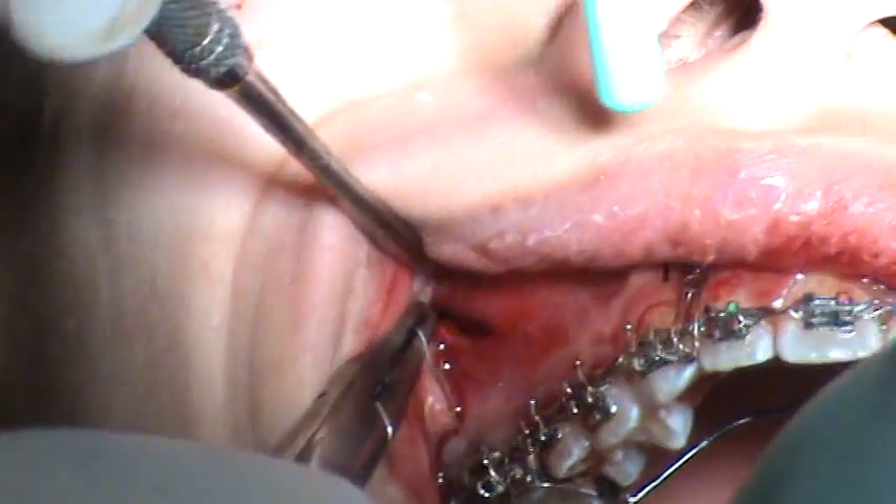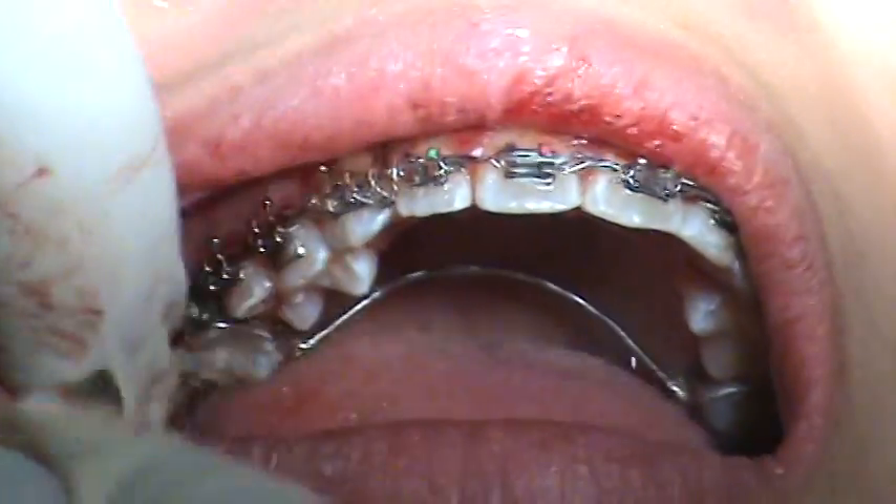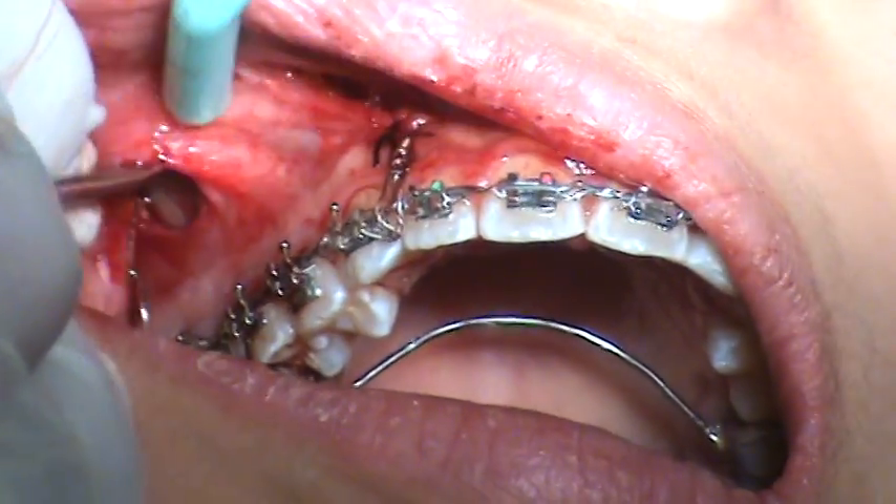I see it's all the way up there. Probably the wire — we just undid it, undid it, undid it. Too much back and forth on that wire.